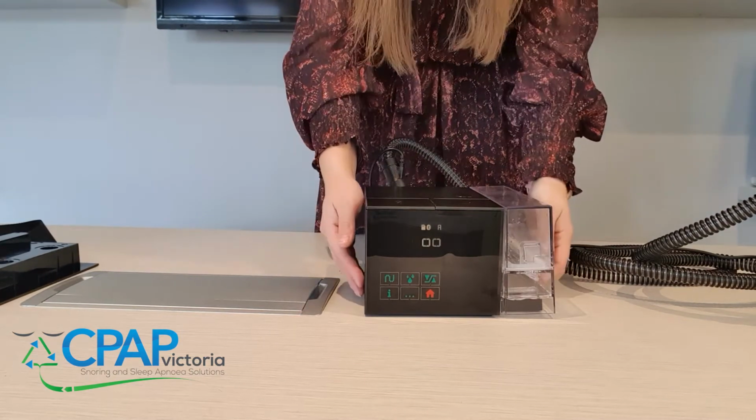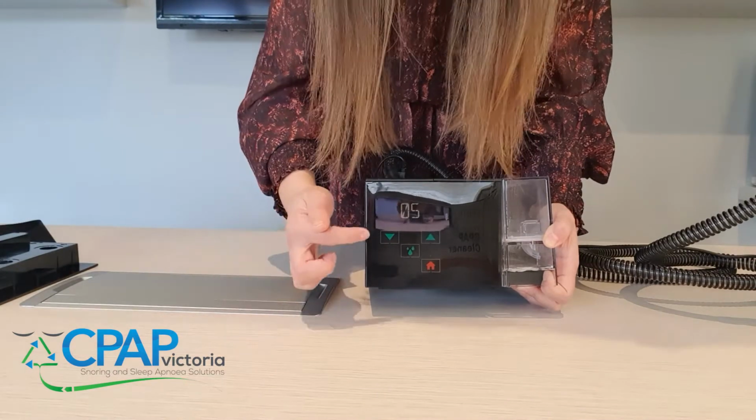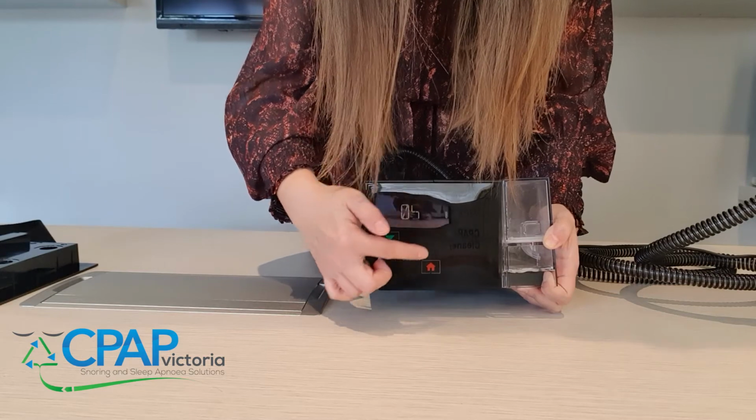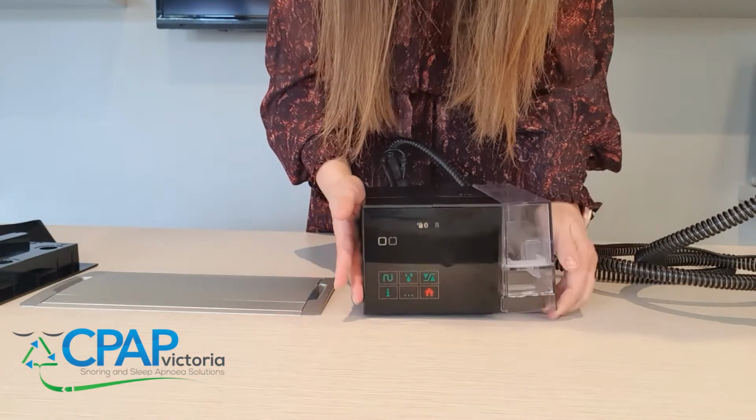We then have the little water droplets on the screen, and this is your humidification level. You just need to press it up or down at any time to choose the level that suits you the best, and you can press the home screen when you're ready.